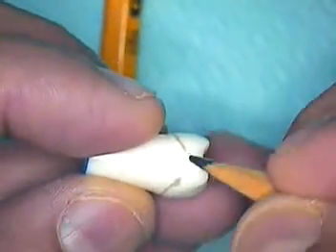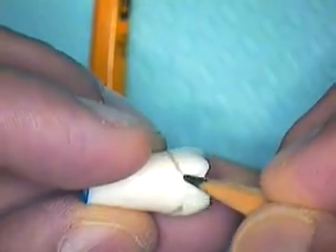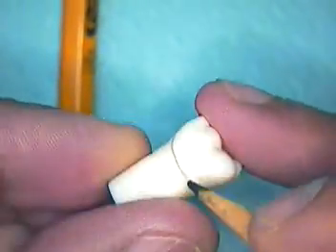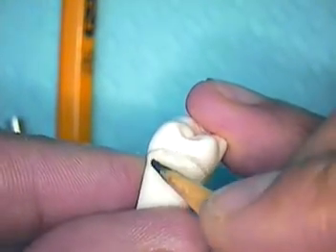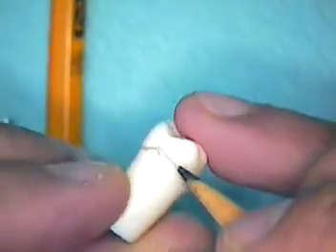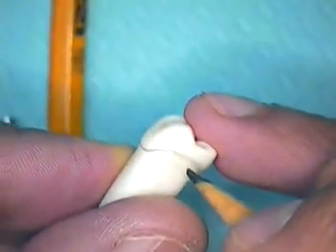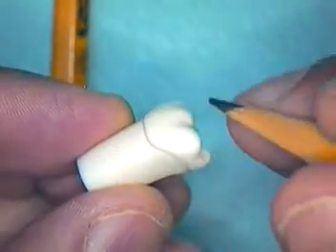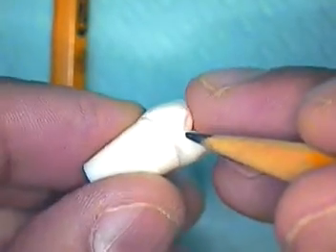Now we can move on. We'll take our tooth with the lines drawn and connect them. It's not that difficult — it's more of a round area in the inter-proximal area, so it doesn't go straight across; it continues with the contour. On the buccal and lingual aspects the line goes down to the gum line, and in the inter-proximal area it goes up and down like a roller coaster, because of the soft tissue called the papilla located between teeth. There are instances where we're closing spaces and I have to go below the gum line, but for today we'll do it this way.